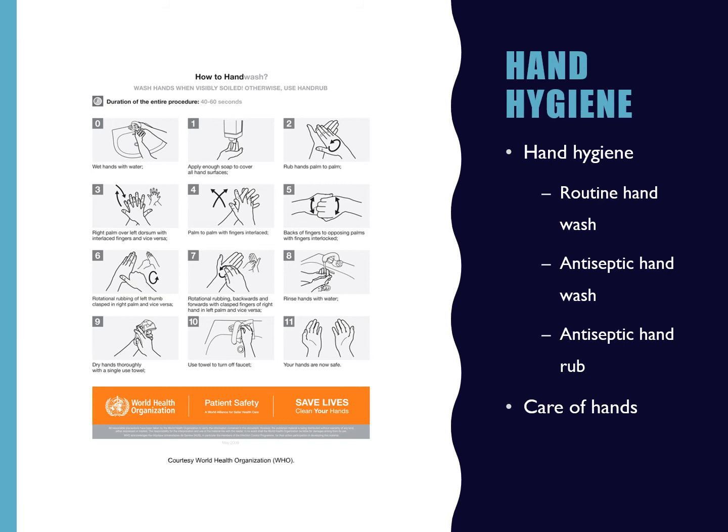And so if you have a cut on your hand, I'm sure you guys went over this in preclinic, but you need to use a band-aid of some kind before you put on gloves. I know that can be kind of annoying to wear a band-aid, and you do have to change those out when you wash your hands, but it's really important in order to protect your hand.